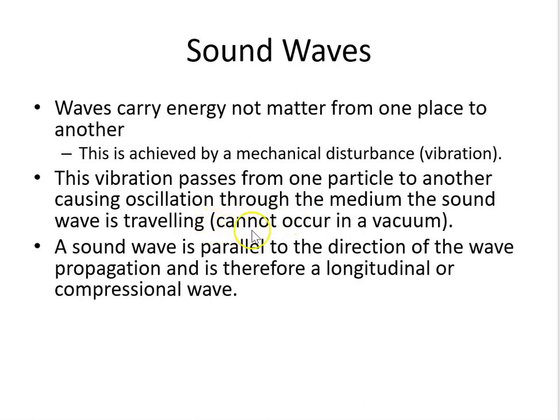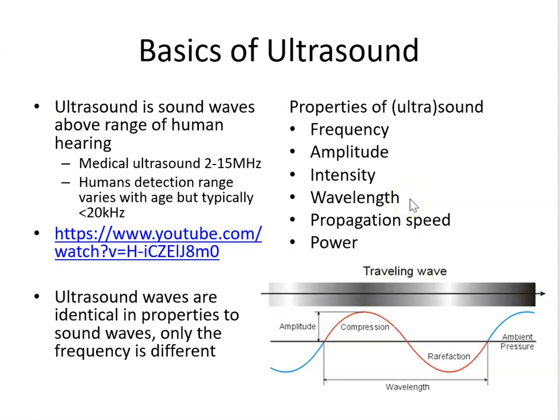And because there are no particles or molecules in a vacuum, sound cannot travel within a vacuum. And the sound wave itself runs parallel to the direction of propagation. So if we've got a point going from A to B, the sound wave itself is parallel to this, and we'll see this on the next slide. And when we're dealing with ultrasound, we're dealing with very short wavelength sound. So medical ultrasound deals in the 2 to 15 megahertz range, whereas humans can detect up to a maximum of 20 kilohertz, so 20,000 hertz.